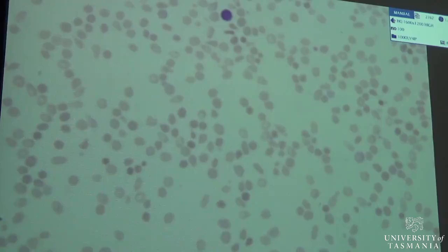Remember when you came up the front here and you had to pass your filter paper with the spots over the fluorescent light? I think that was only 2 weeks ago. Long time ago in university terms, isn't it? Or you can do an assay for G6PD deficiency. Okay. Has anybody got any questions about that blood film? No? Okay, let's go on to the next one.